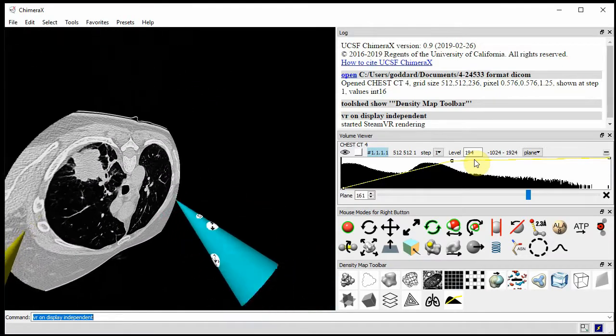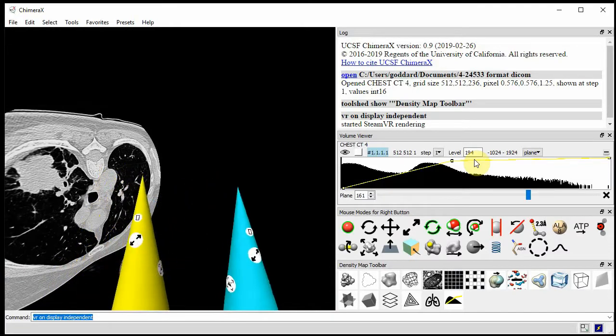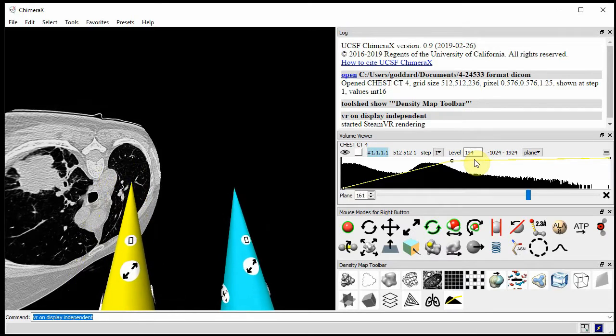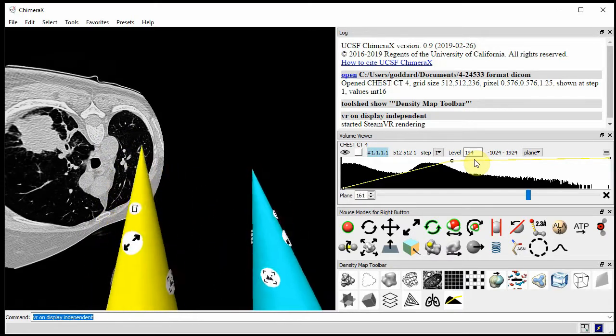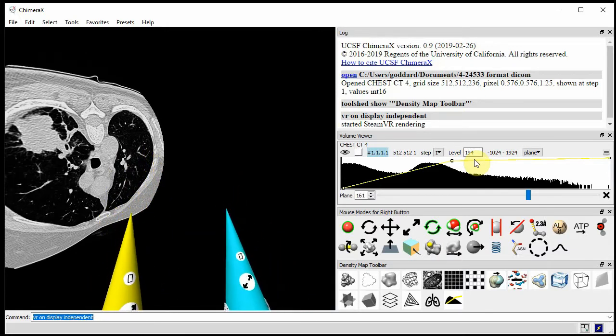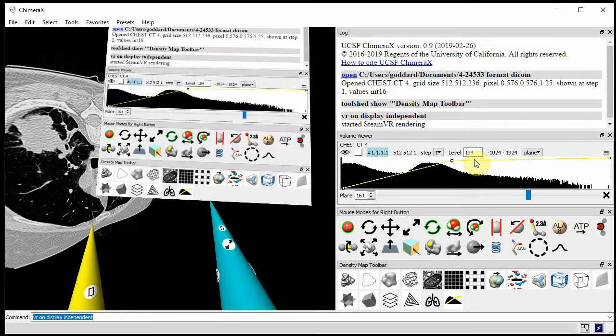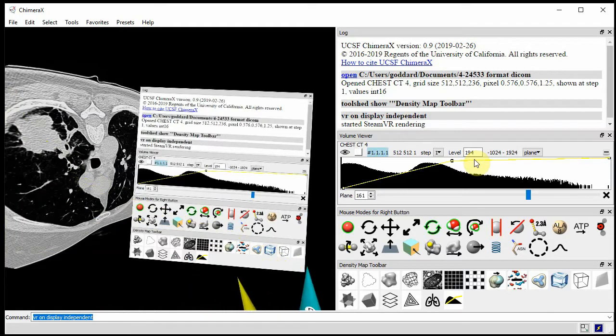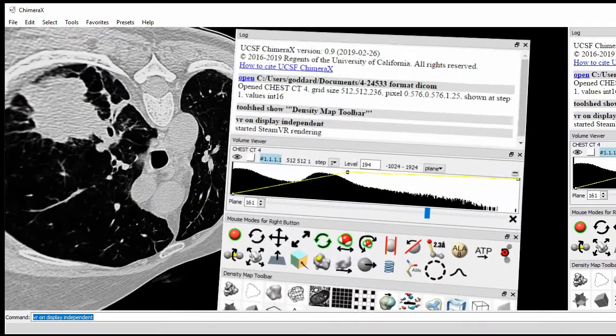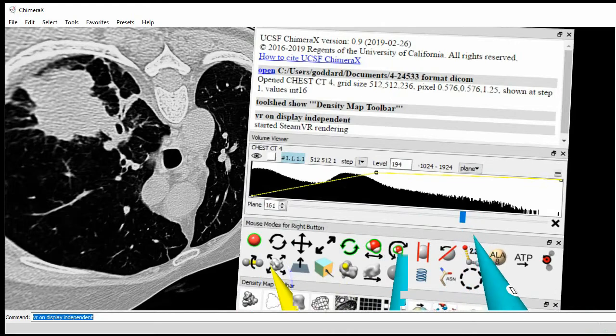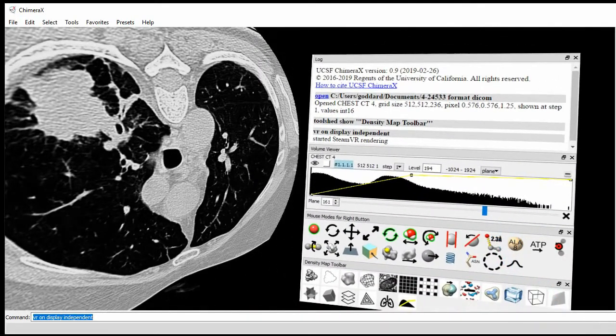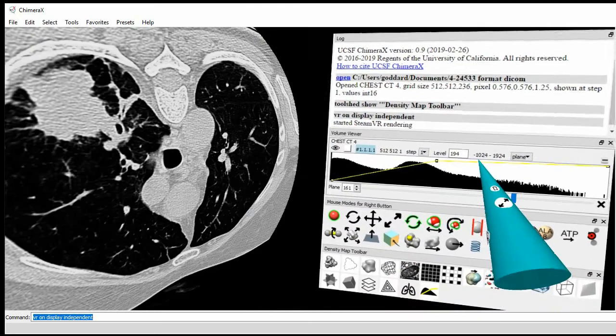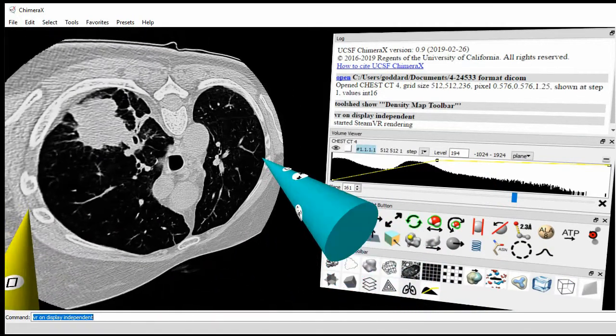I'm going to position the little user interface panel. I'm using the Vive Pro. I got the Vive hand controllers. They look like cones in the VR. They've got buttons on them. One of the buttons, the little rectangle, brings up the graphical user interface. It's the menu button on the Vive controller. Let me try to position it in this video. Actually, let me resize the Chimera window on the desktop display so that you'll get a better view in this video. Let me position the window. I just position it by holding the menu button on the controller and moving it. That looks like a good position.